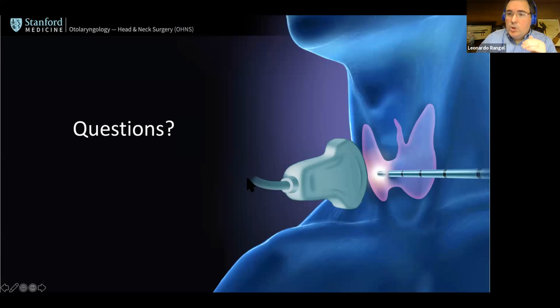But at this point in time, one benign nodule, huge, apparent, symptomatic, with normal thyroid function, I would challenge that this patient is not surgical anymore. This patient should be treated by radiofrequency and not by surgery anymore. All the other patients may be debatable, but this one, a benign, apparent, symptomatic nodule with normal thyroid function, is definitely for radiofrequency.